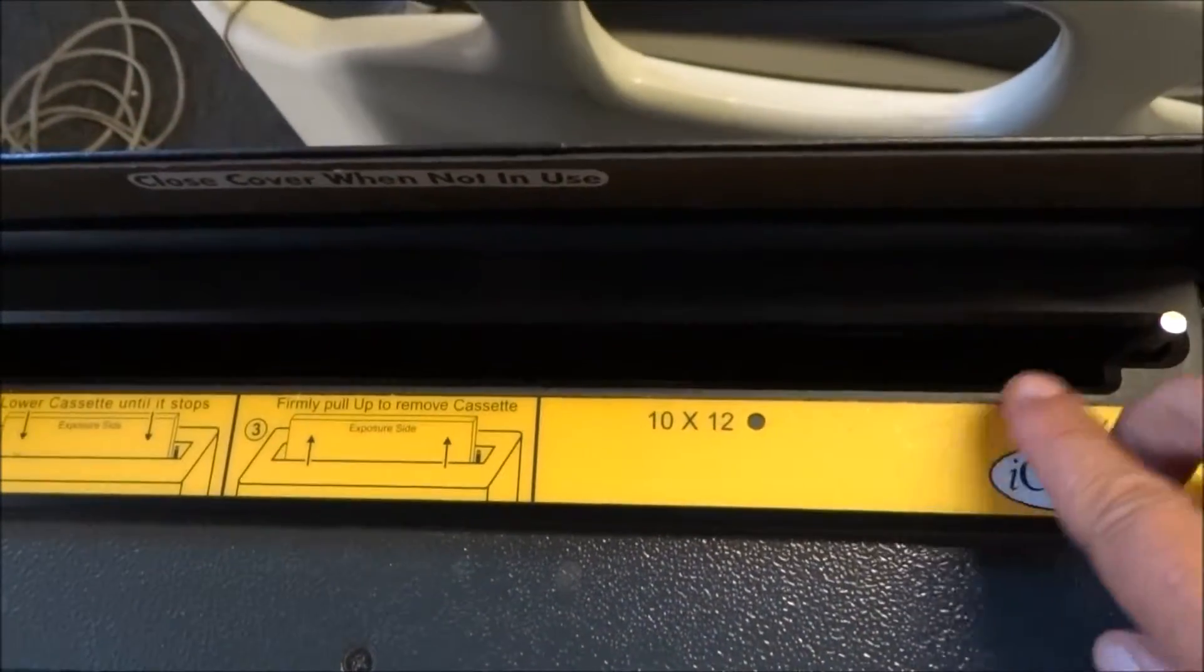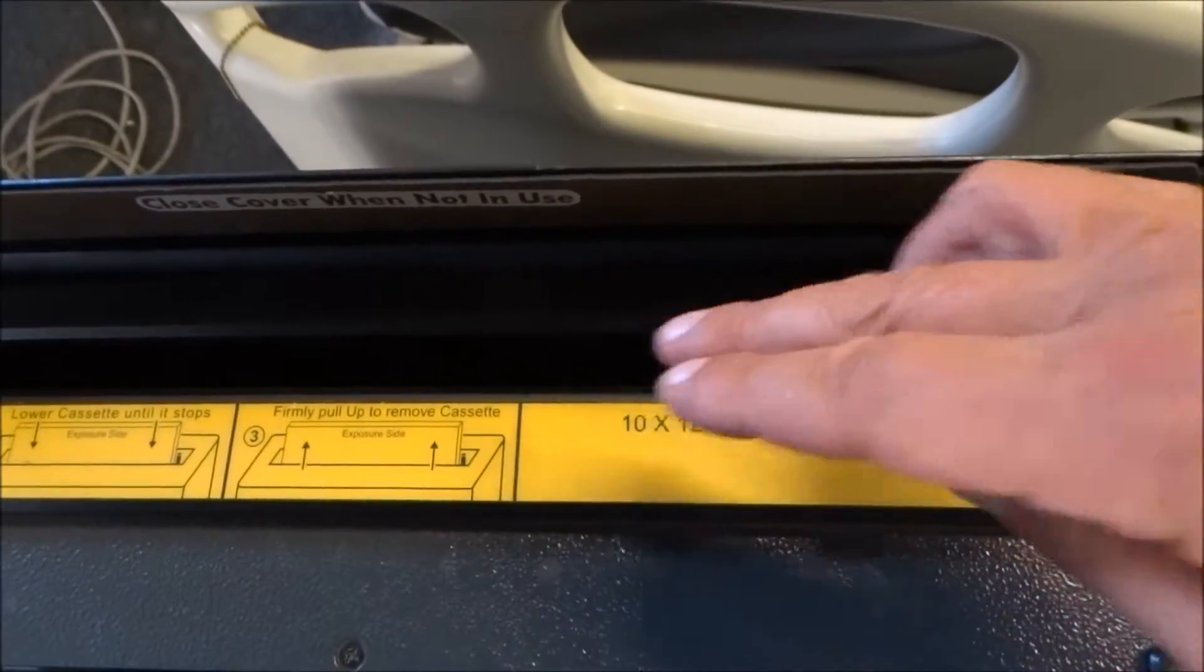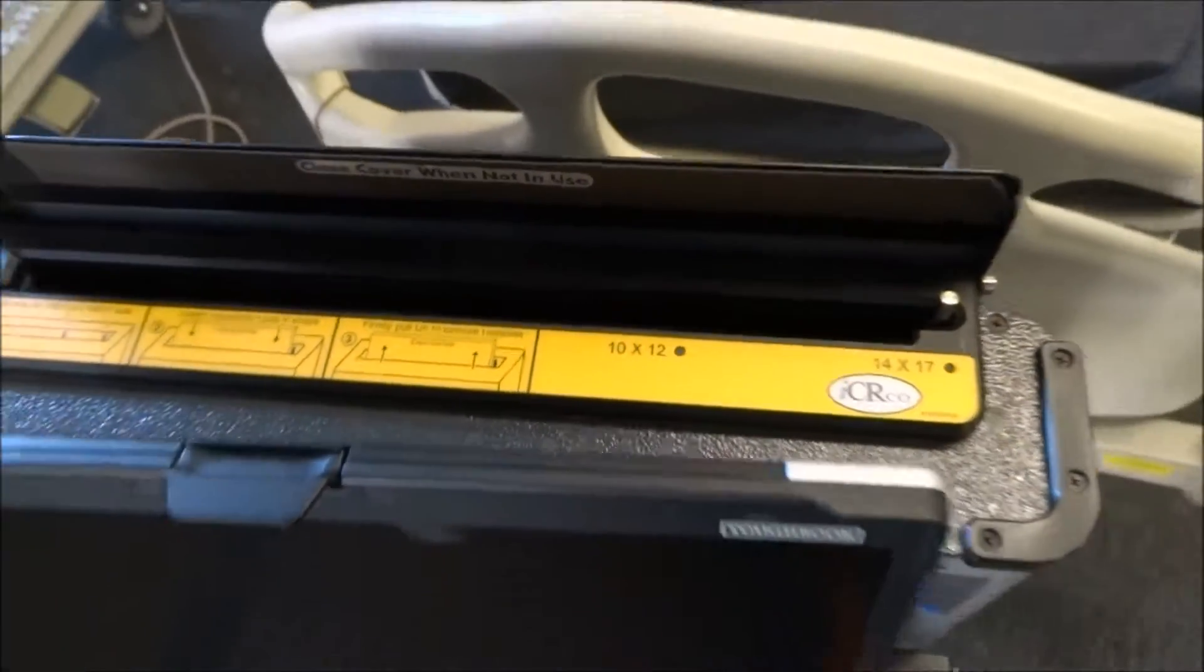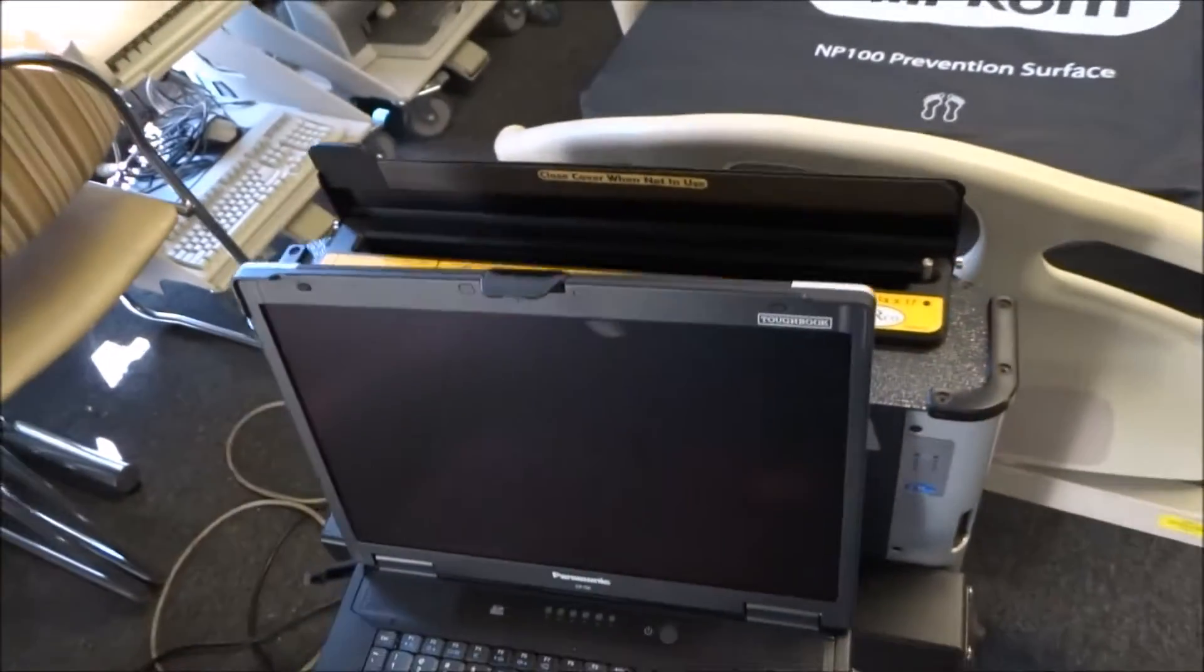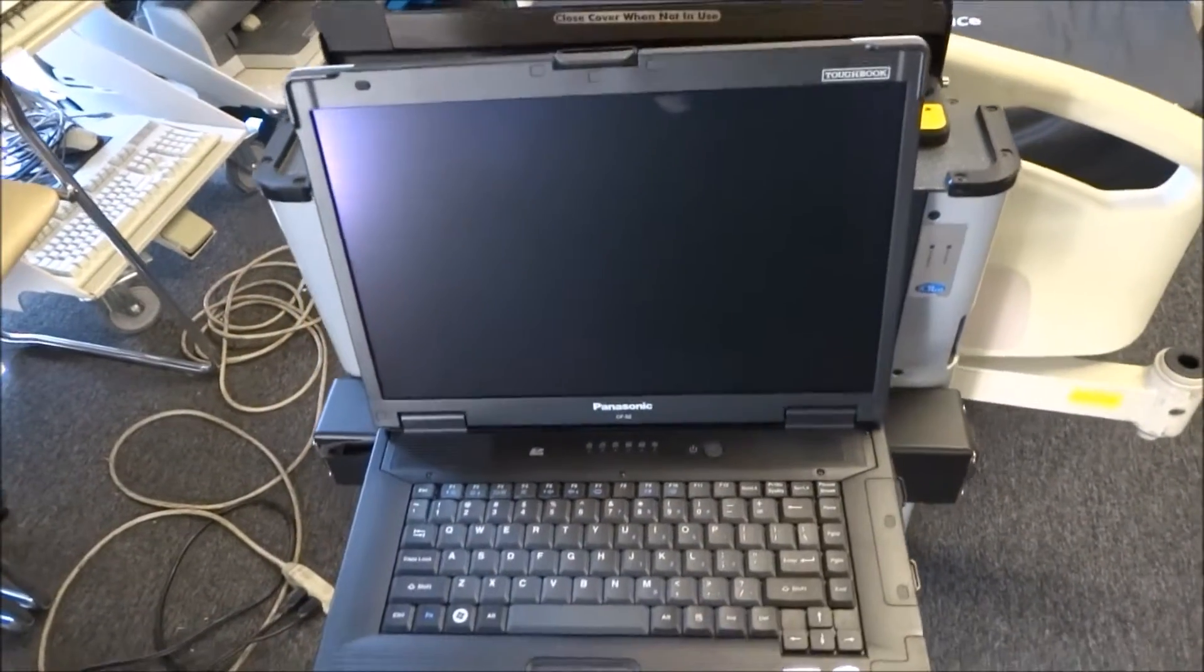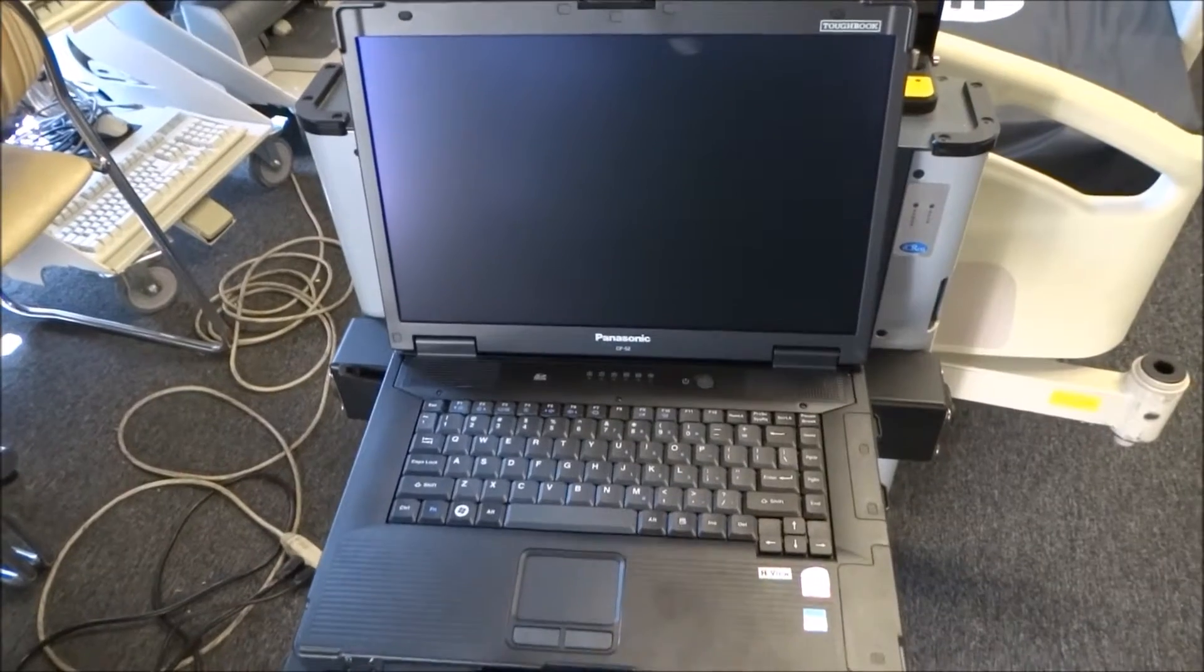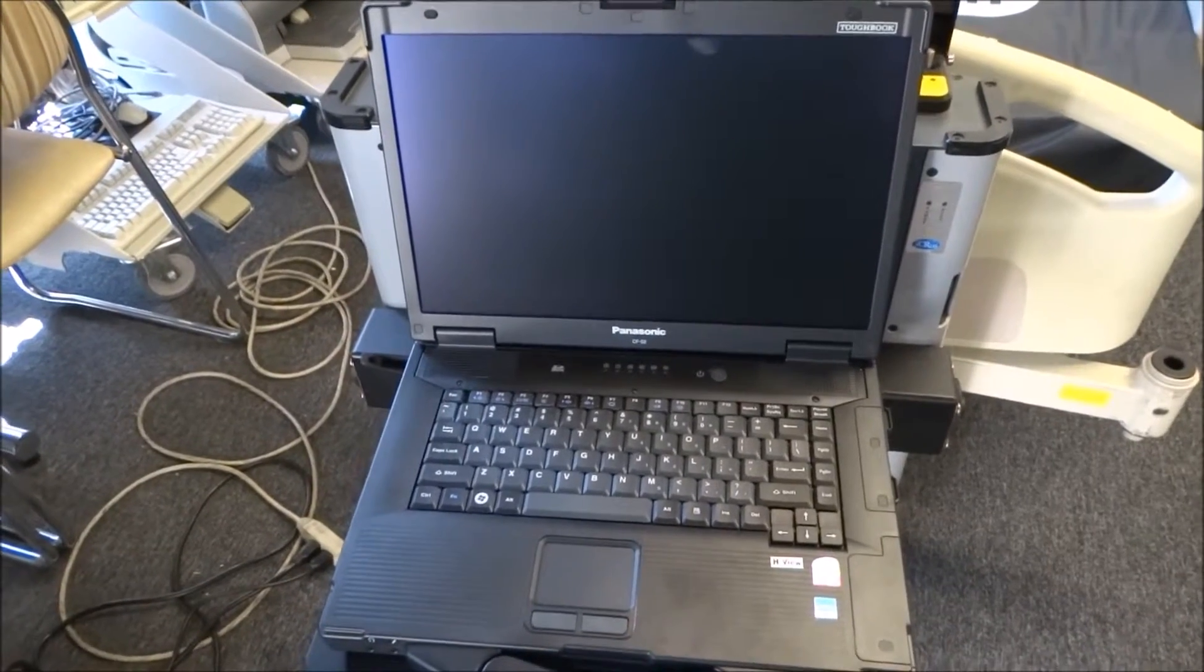This piece right here is going to adjust the width of the slide and then what's going to happen is the slide is going to get put in there, drop down, and then you're going to get a visual image here on the PC.